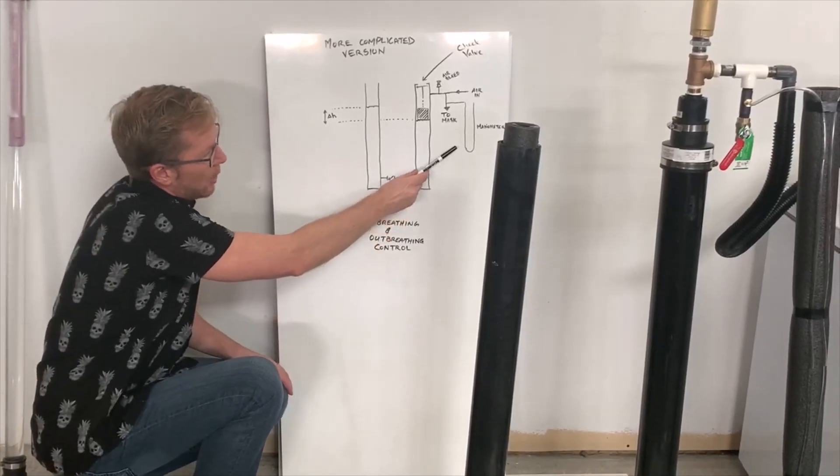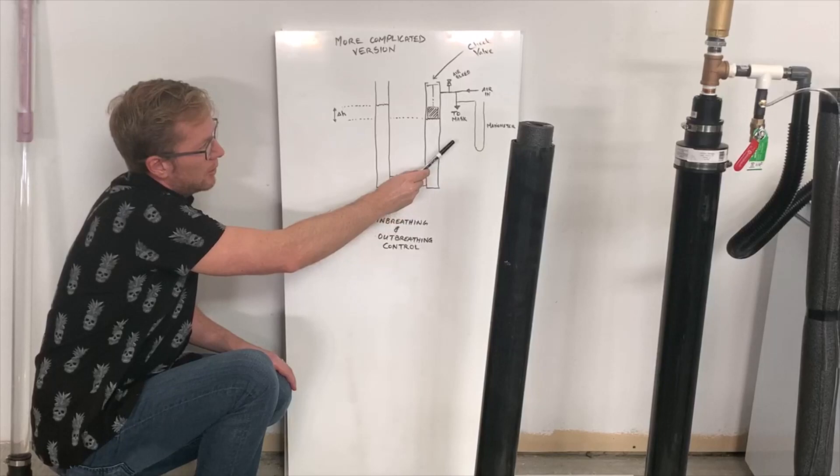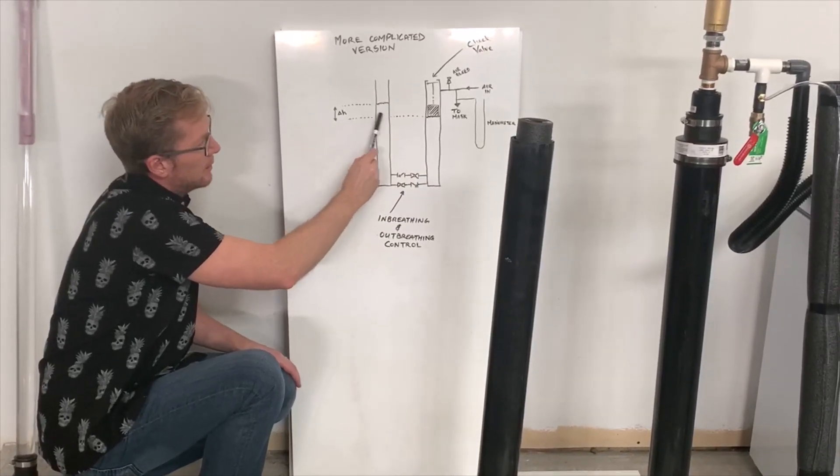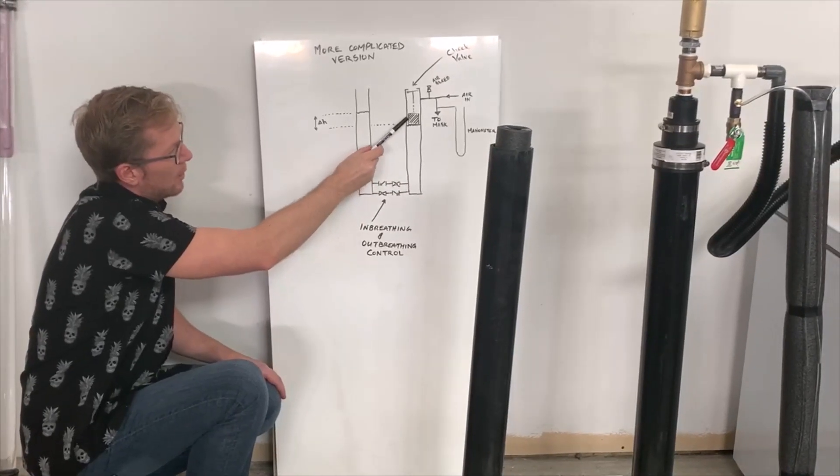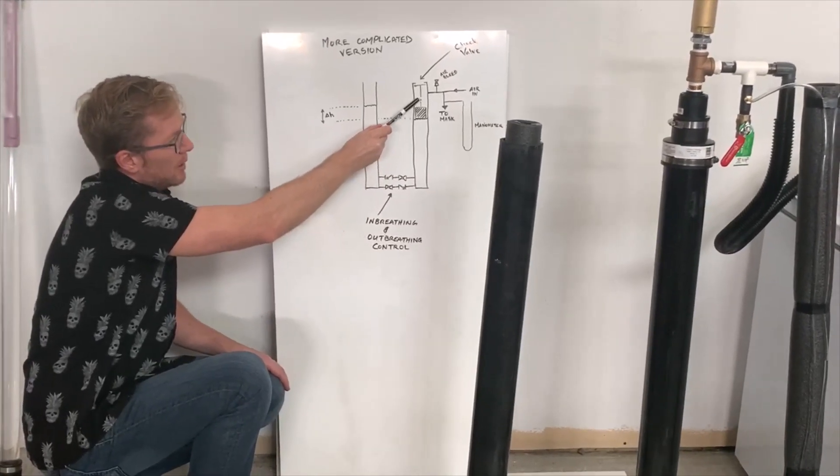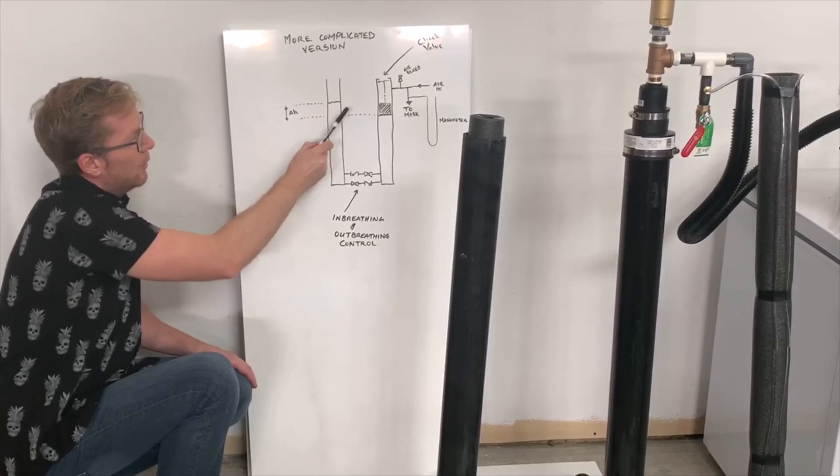We added a manometer to confirm that the pressure at the mask corresponds well to the height difference of the water columns. The height difference can be adjusted simply by adjusting the length of the chain on the float.